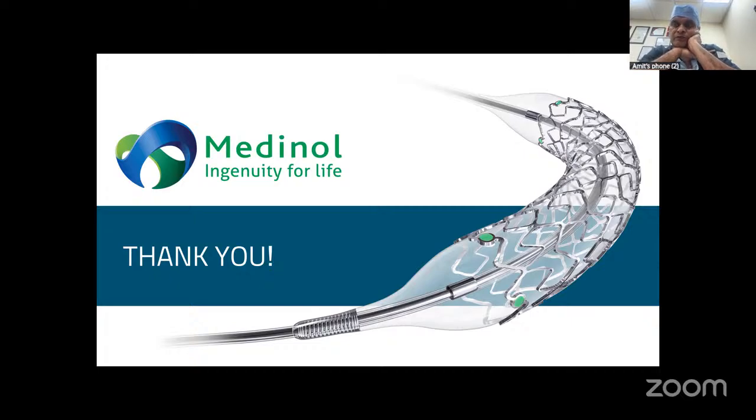Dr. Manoharan, you would like to add something to the discussion? It's a good stent. It's only available for the past 1 month in my center. I used it for more than 10 cases. In small vessels and calcified lesions it is easily trackable, and the marker is very useful. It reduces the radiation dose also to the patient as well as the operator.